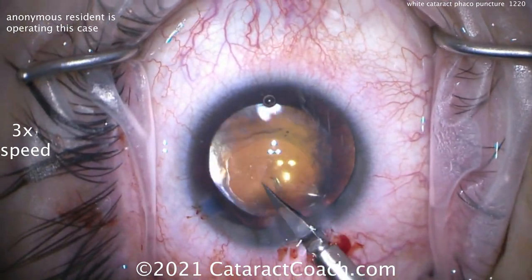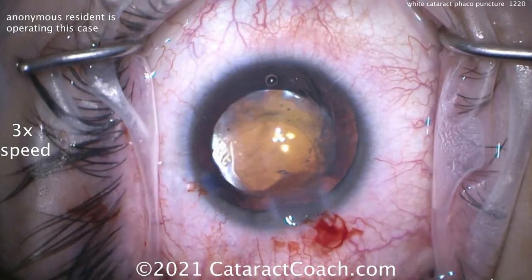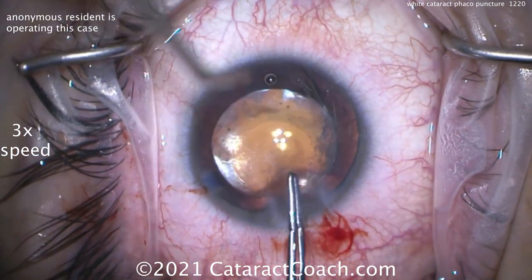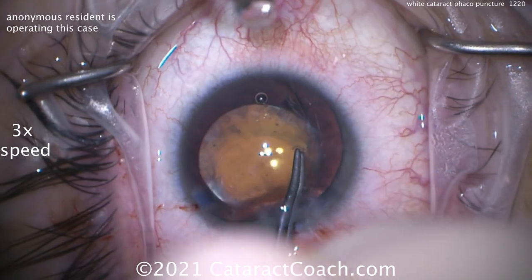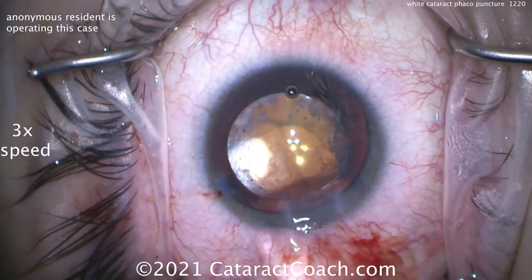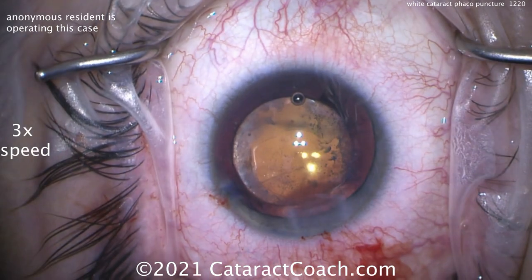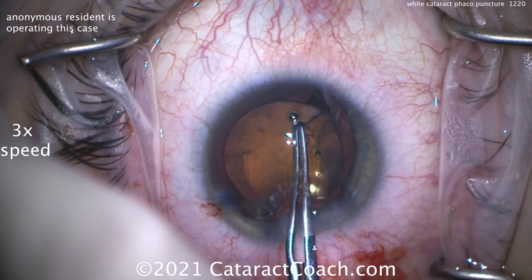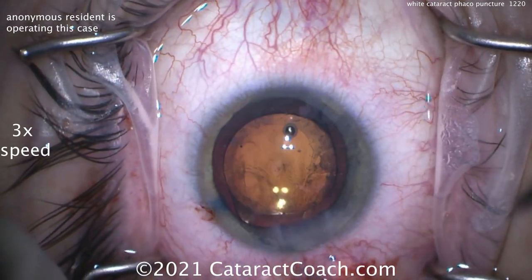Now we know where we want to enlarge the rhexis. In the sub-incisional area it looks pretty good. Let's get those little Vannas scissors — little baby scissors — and nick the capsule one direction or the other. I'm giving the resident some guidance: try and nick it maybe over there, and then you can enlarge it. You can use the cystotome instead of the Vannas scissors. Now grab that little nicked area and continue the rhexis, and you'll get a very nice rhexis out of it. Now you can enlarge this rhexis to whatever size you want — grabbing it with the forceps and pulling it.